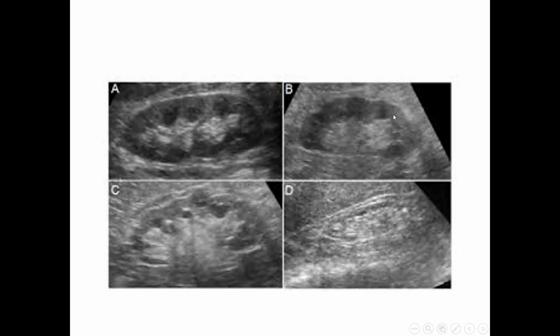So as disease progresses, or in diabetic or hypertensive patients, the nephrons lose their function. So the kidneys become smaller in size with time, and the thickness of the cortex reduces because the nephrons are disintegrating. This is another case where the disease is further advanced. Again, the cortex has further reduced. And here, this is end stage disease, where there's a very thin rim-like structure of cortex, and the rest is the medulla. So all nephrons are gone here. That is why this is end stage disease.